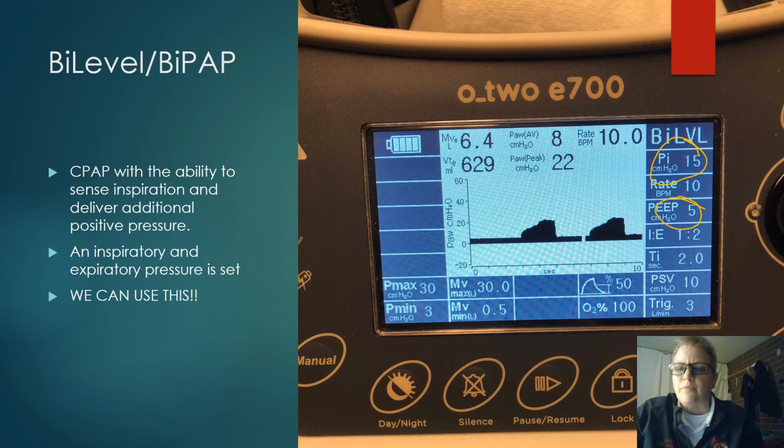So just play with it, okay? That's how you kind of figure out if it's comfortable or not, and figure out how your patient is doing. And if you start on bilevel and they're not doing very well on it, go back to CPAP with pressure support. You know, we've got options here.